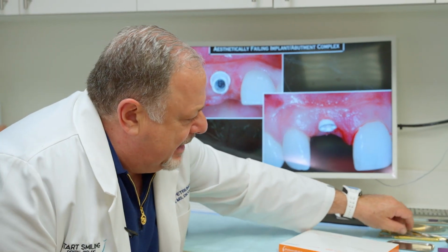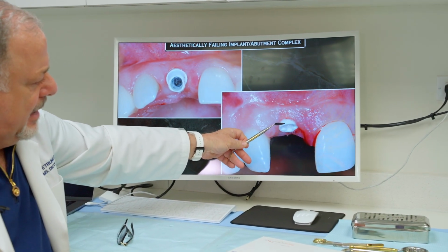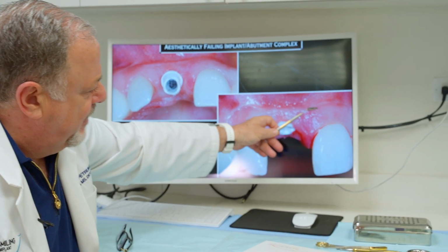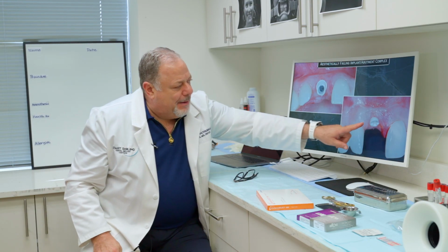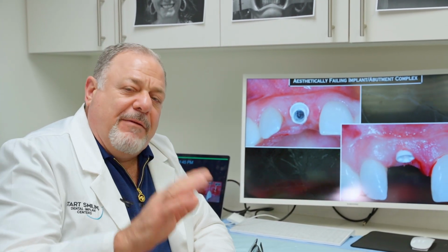So if our implant head is here, in relationship to the facial height of contour of the bone here, we're already two or three threads out. Now, if this implant was constructed by compressed zirconia fabrication techniques, you could prep on the implant itself, create a facial chamfer margin, make a new crown, and possibly do a connective tissue graft to advance the flap forward. You have that flexibility with zirconia implants that are compressed.